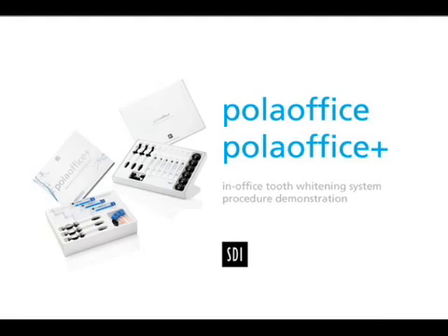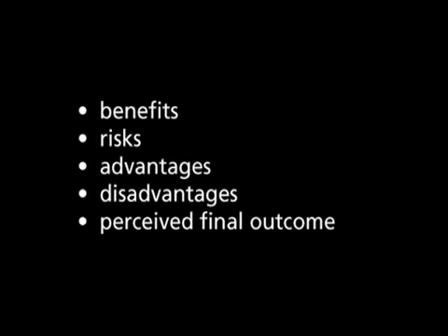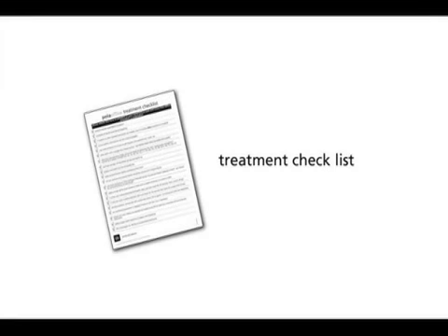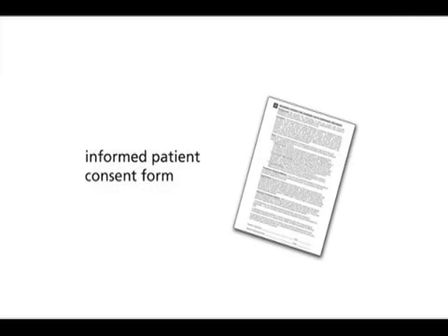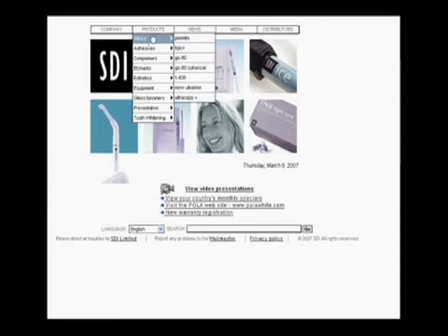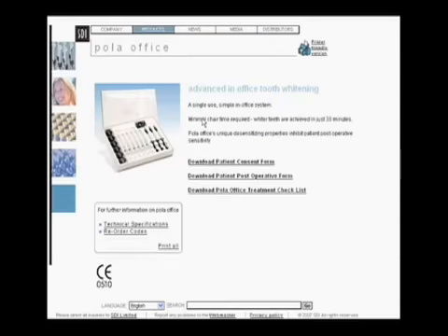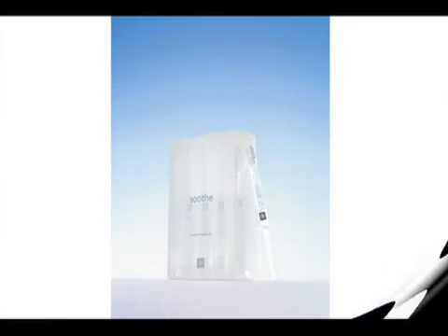Before starting treatment, carefully review the patient's medical and dental history. Thoroughly discuss the benefits, risks, advantages, disadvantages, and the perceived final outcome of each treatment option that is available. To assist you, a treatment checklist and informed patient consent form is available for download on the SDI website, www.sdi.com.au. Go to the Tooth Whitening Pola Office tab in the Products menu for this information.